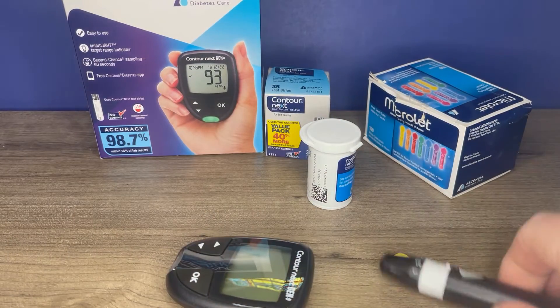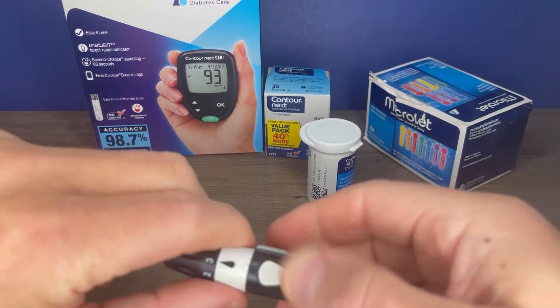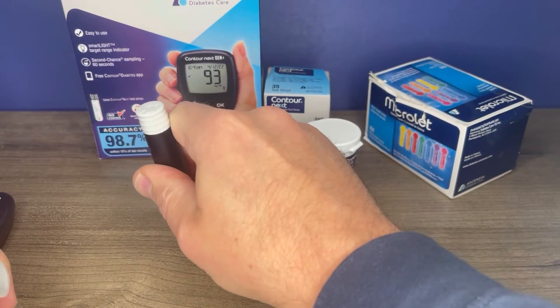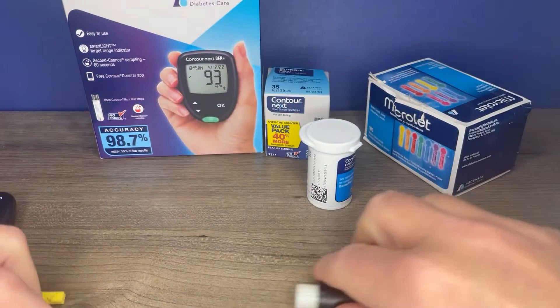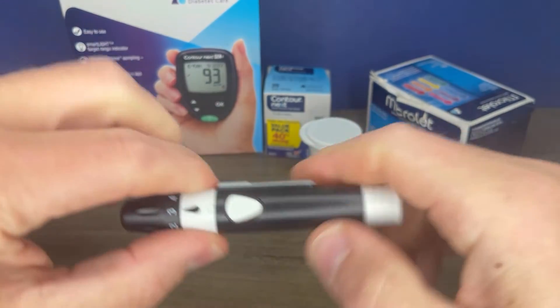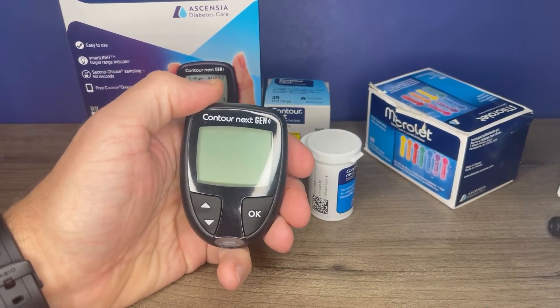Remove your test strip and dispose of that properly. We did go over how to remove the lancet, but to recap: take it out, jab it into the top of the cap, and you can eject that right into your proper disposal container. Place the lid on for next time.